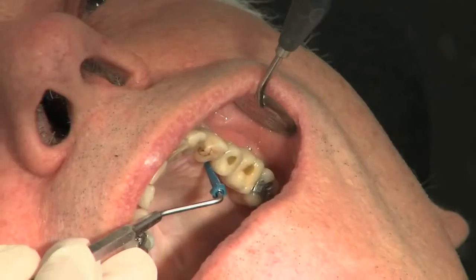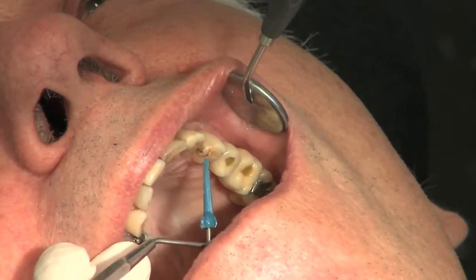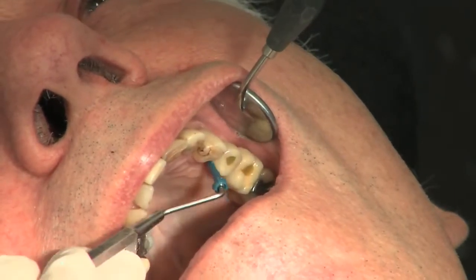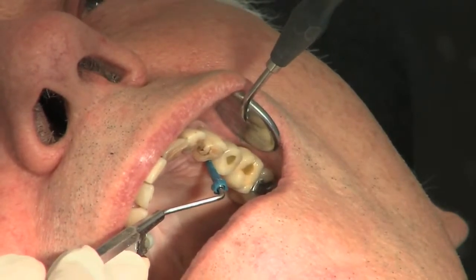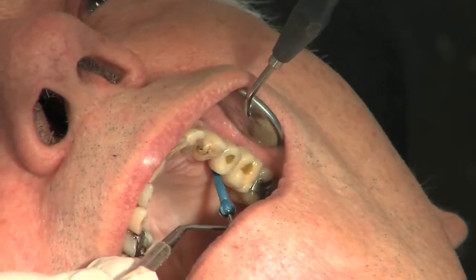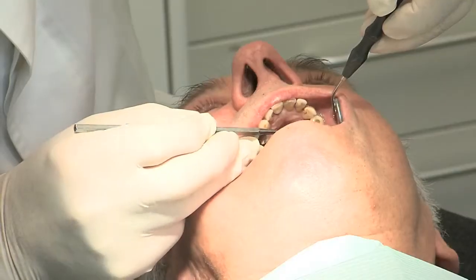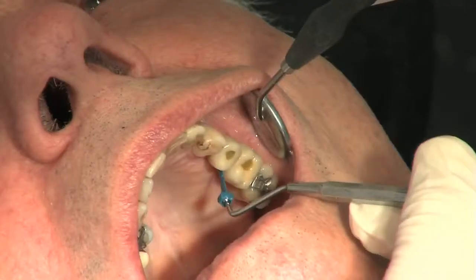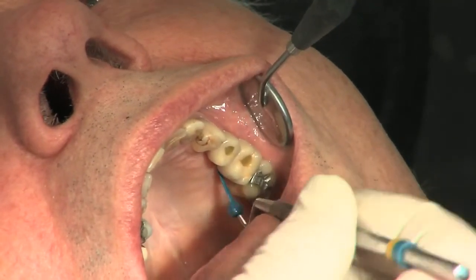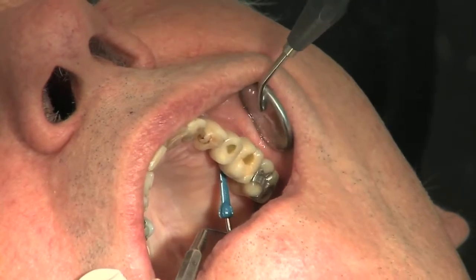When I probe around here I can measure — this is a flat plastic probe that measures at 3, 6, and 9 millimeters. I can enter here around three palatinally, also three distally, around three to four. Now going to the next implant: mesially we have two to three millimeters, palatinally it goes up to five, and turning backwards again we have around four to five.